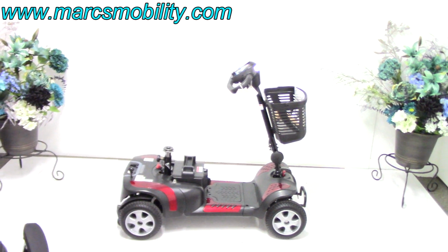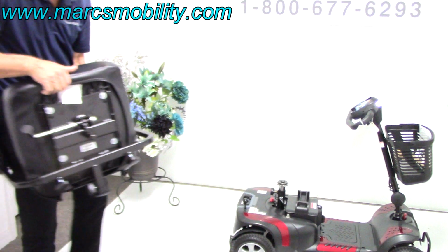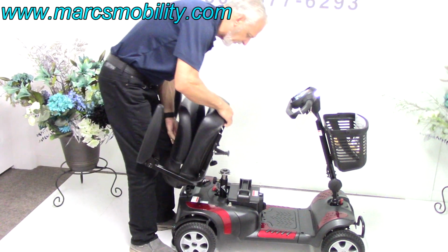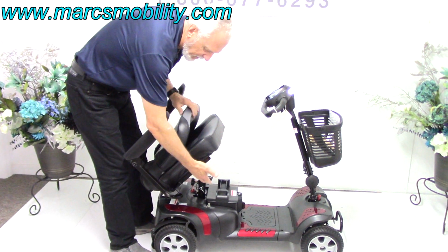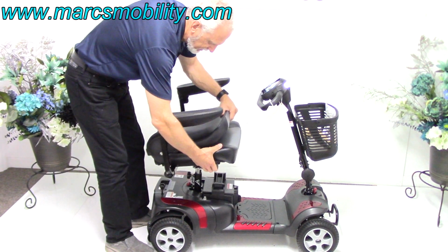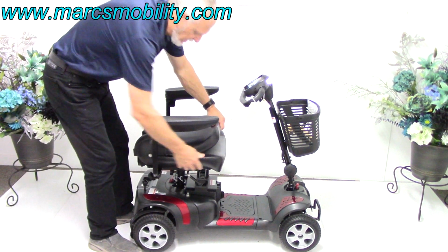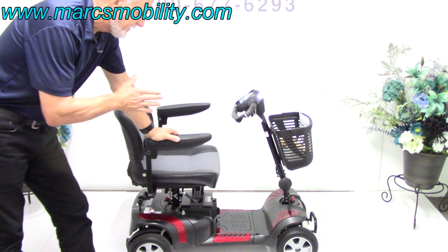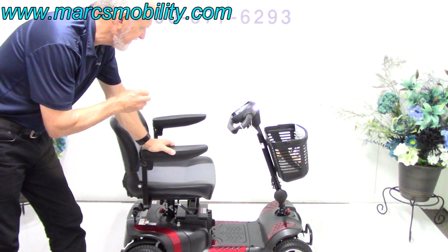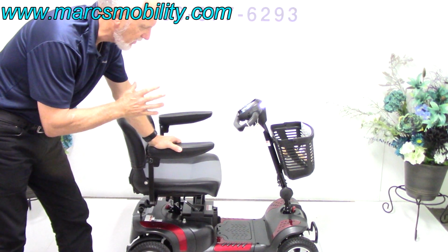When you grab your seat, grab it this way so you can see the male piece right there. So you bring it over there. It's already going to fall in. Make sure this is up. Flip it forward. Let it fall in. And now release the lever and it locks it. So that's how you would take the Phoenix HD 350-pound weight capability apart.